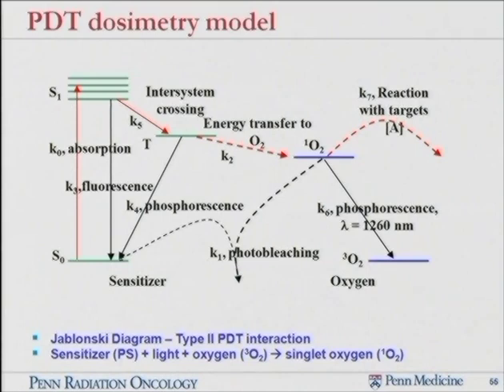And this is the quantity that interacts with either the target cells to do the damage, the treatment, or photobleaching. Brian has mentioned using photobleaching during the treatment, and that could be one method. But what we are currently doing is based on explicit dosimetry of individual quantities and trying to tie them up using this so-called macroscopic model.